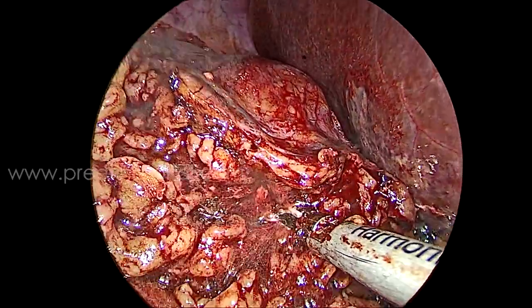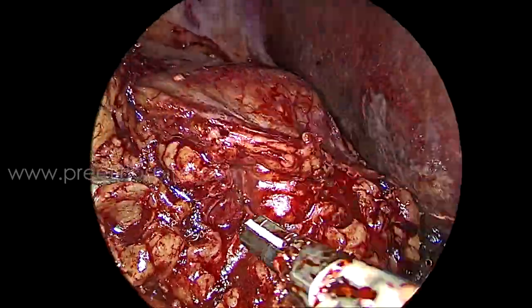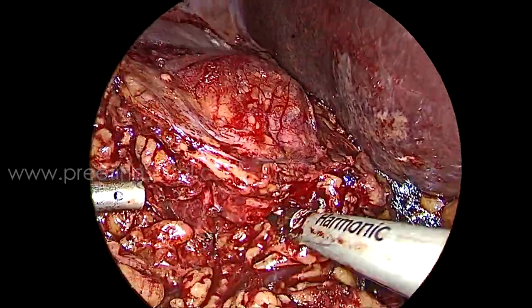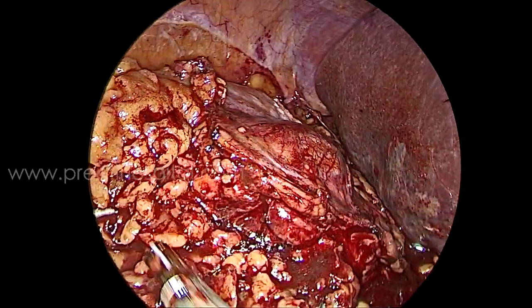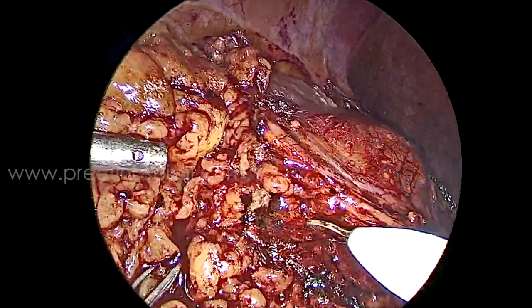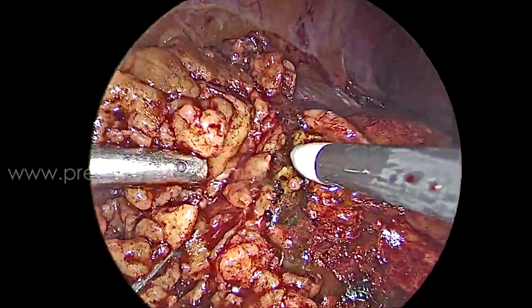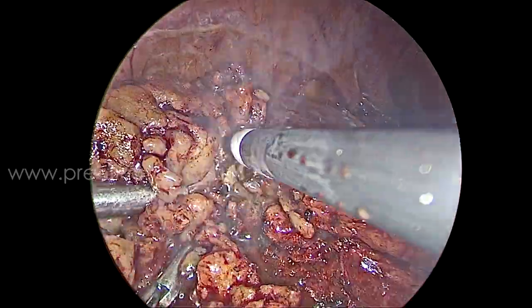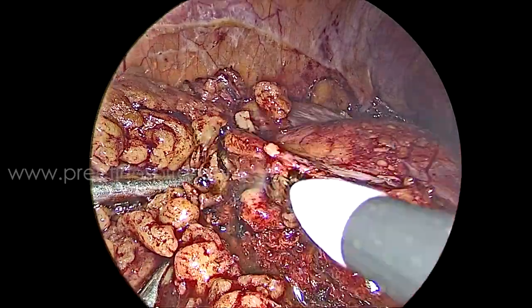How deep to go — you don't know. Fat kept coming. The instrument that got maximum utilization here was the spatula, where I was coagulating and then forcibly separating. Even then I was not able to see the capsule.